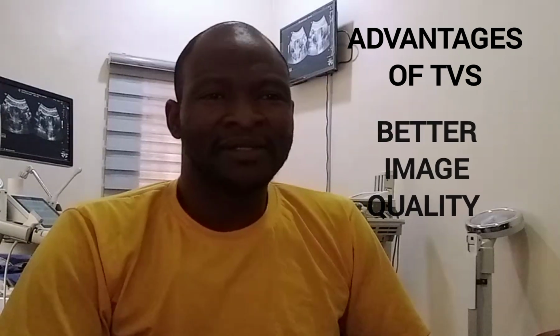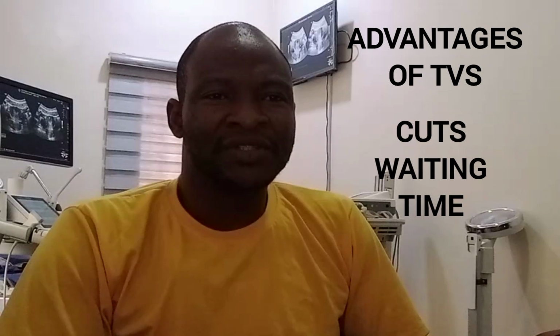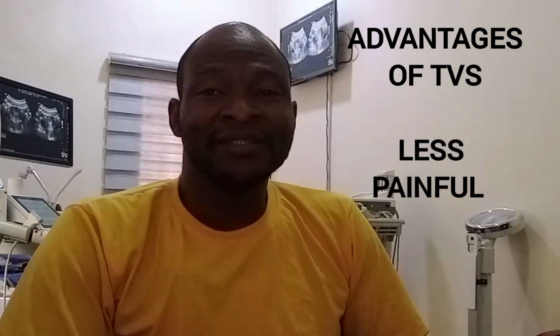So what are the advantages of transvaginal scans? Transvaginal scan advantages would include proximity to pelvic organs with a higher frequency transducer that allows better tissue characterization. It does not require a full bladder. That means it saves valuable time. Empty bladder scanning is less painful.